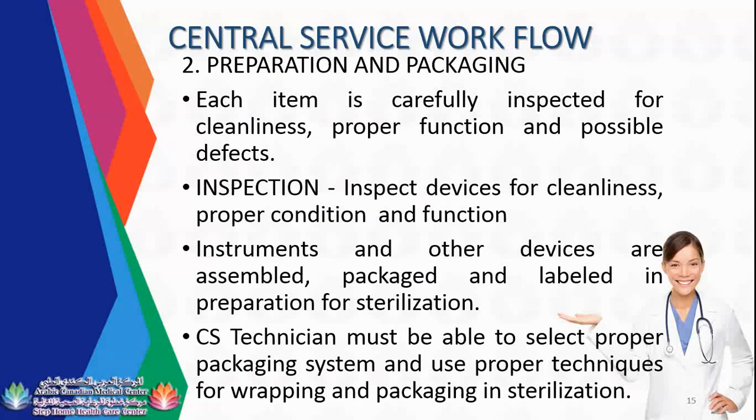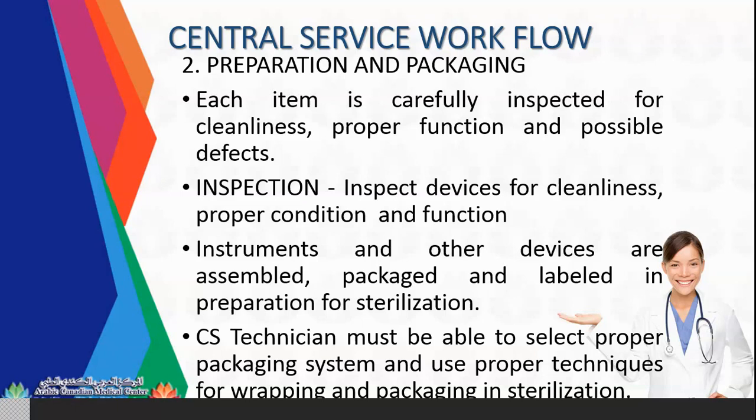Once you are done rinsing the instruments in distilled water, you can proceed. You can send the instruments to the preparation and packaging area. In this area, each item is carefully inspected for cleanliness, proper function, and possible defects. Inspect the device for cleanliness, proper condition, and function. You need to check all instruments in this area to see if they are still working or not.